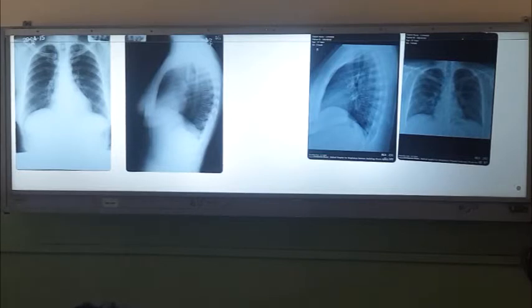So we have a lot of TB patients. At the end of the treatment, we do a chest X-ray and ask them to keep it. So the next time when they come with symptoms, to look for reactivation or to look for some other pathology arising there, you have to have the previous X-ray. You have to keep those two and compare. So all the X-rays are very important. Ask them to keep them. Right.